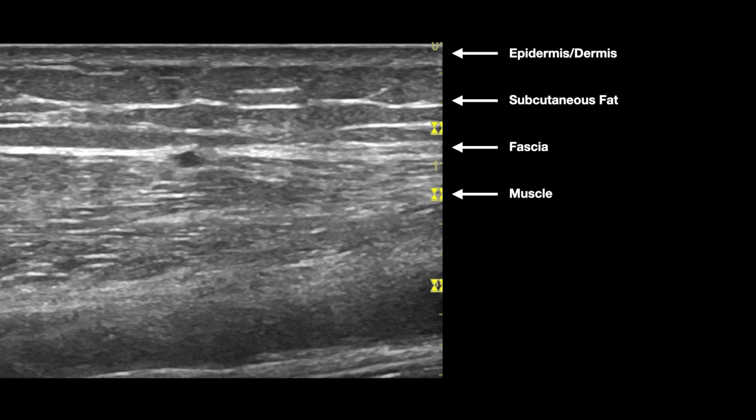A couple of characteristics I want to point out and reemphasize are in that subcutaneous fatty layer. It has that mid-gray echogenicity. You can see that it's not black, not white, it's just that mid-gray, but it also has that very marbled appearance. Imagine a nice, beautiful slab of marble, like the architecture from the ancient period, or a marble countertop. You can see the rock and those veins that run through it. We're going to see that kind of echo texture in the subcutaneous layer, with tissue in between all the layers and the lobules of the adipose tissue.